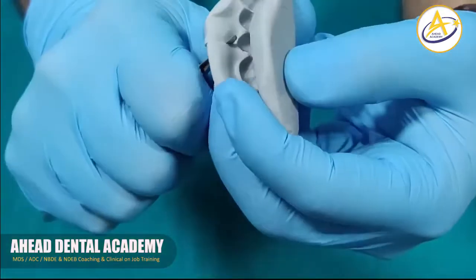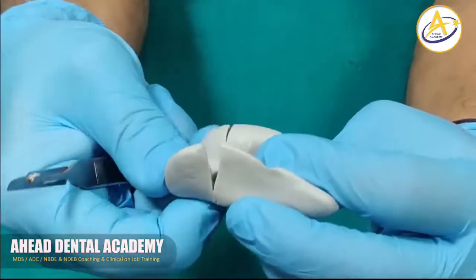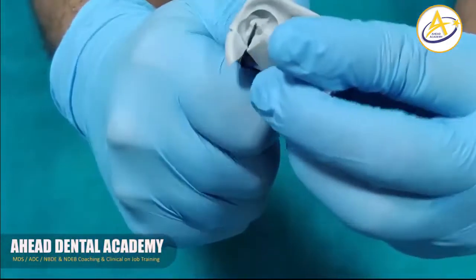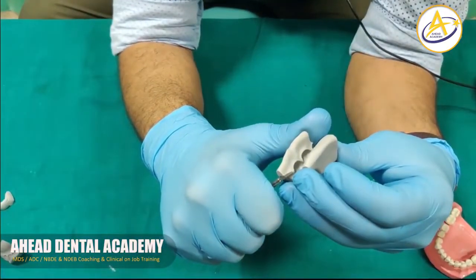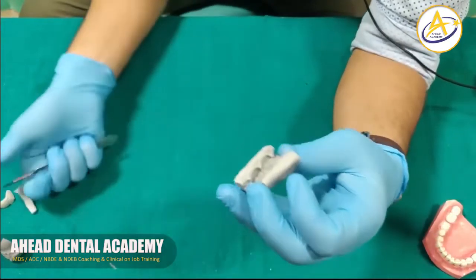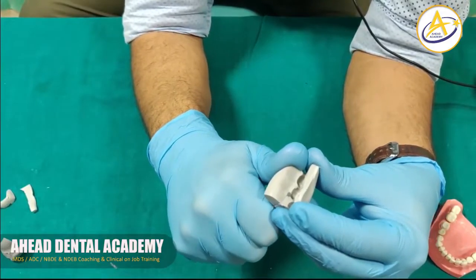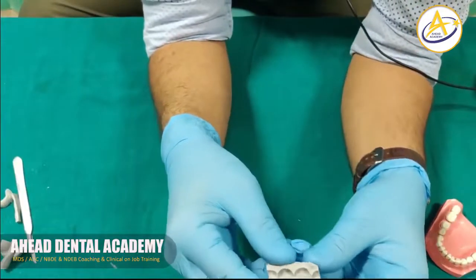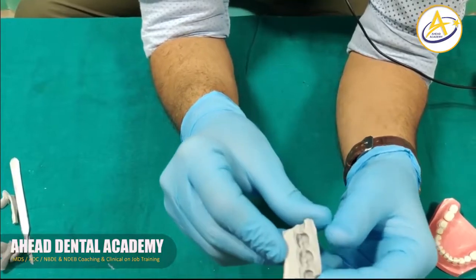So we cut off any extra part that was obtained in the index, because we won't be needing it. Use a scalpel to trim any excess from the index, and this is the tooth that needs to be prepared, and these are the adjacent teeth which will help as a vertical stop.